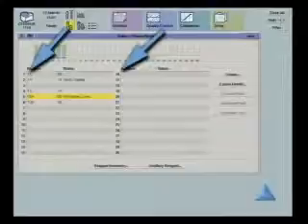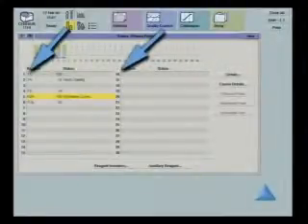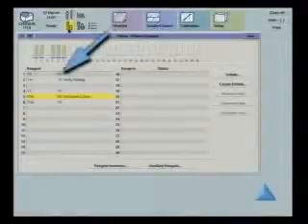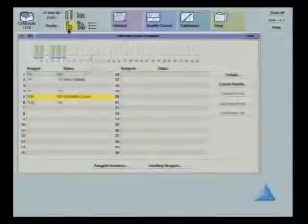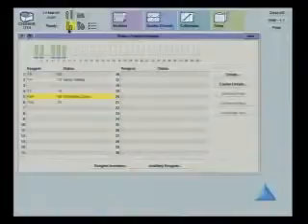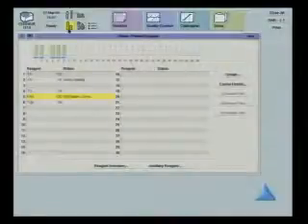The Status Primary window displays the position numbers of each pack in the reagent compartment, along with the number of tests available in the pack, and any status messages. The pack indicators also change colors to indicate if the pack is available for use. The pack positioning may be neutral or yellow, depending on the status messages.